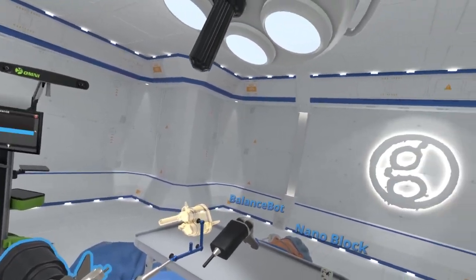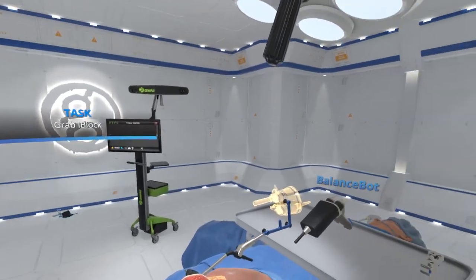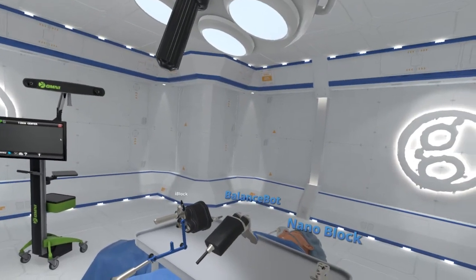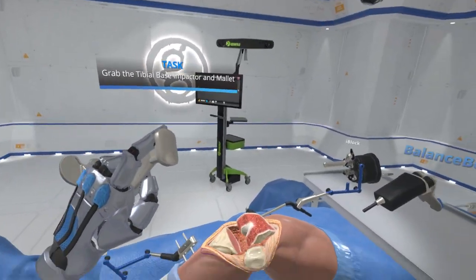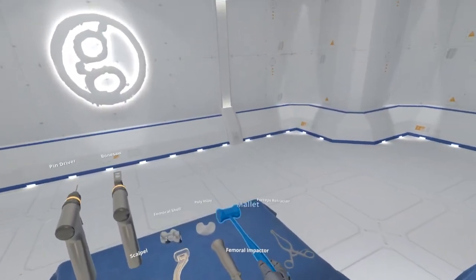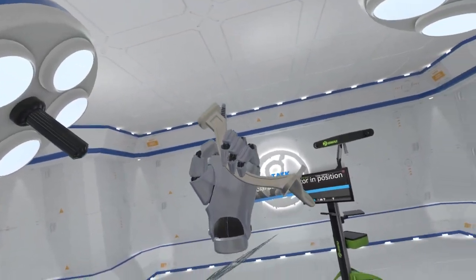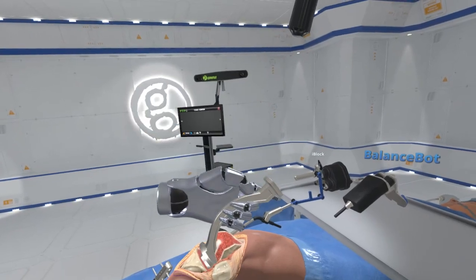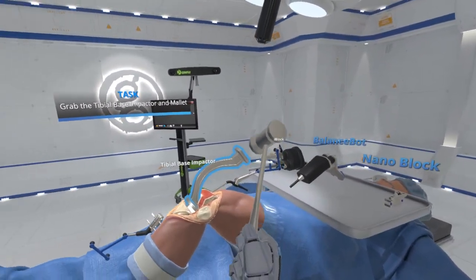Grab the eye block and return it to the Mayo stand. Grab the tibial impactor and mallet from the Mayo stand. Hold the tibial impactor in place. Now strike the impactor strike pad with the mallet to impact the tibial tray into the tibial plateau.